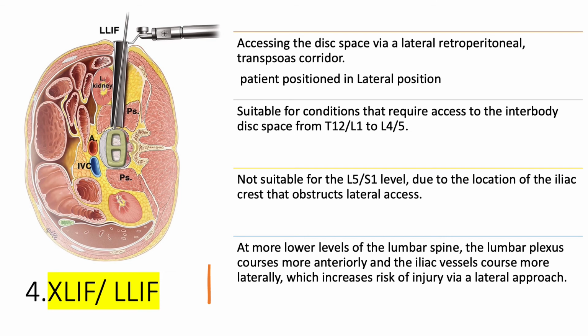Now let's talk about the lateral approach, which is the extreme lateral interbody fusion or a lateral lumbar interbody fusion. This involves accessing the disc space via a lateral retroperitoneal transpsoas corridor. So it's a lateral approach through a transpsoas corridor into the disc space.